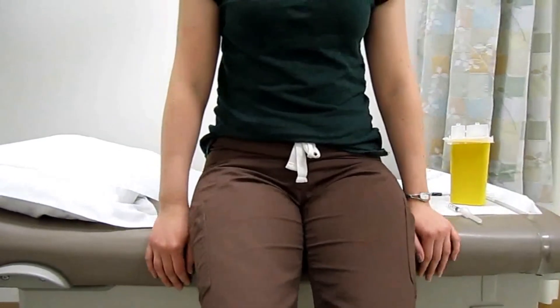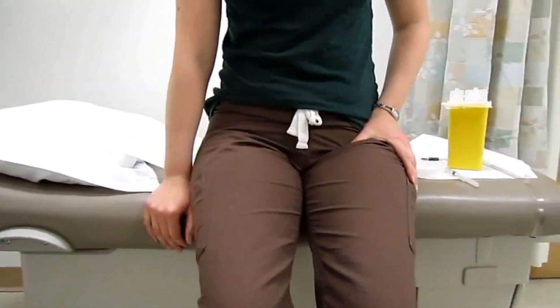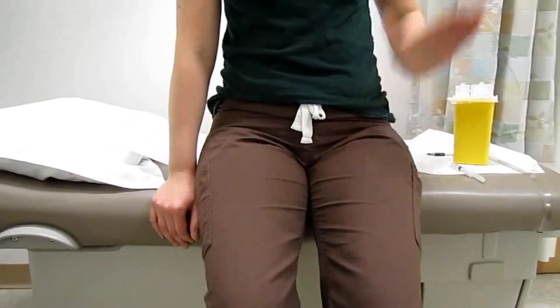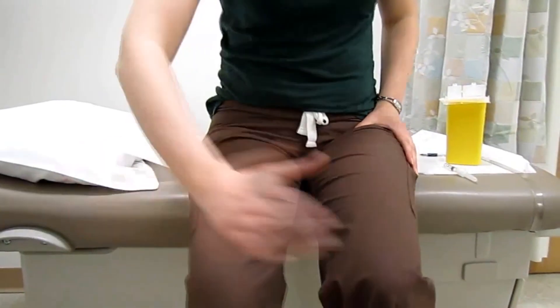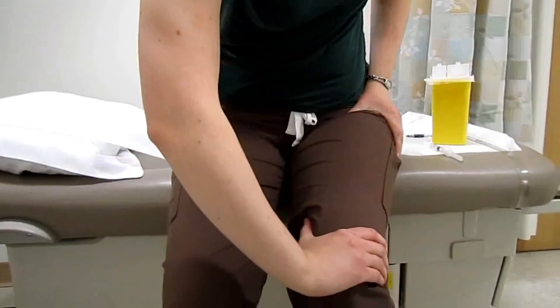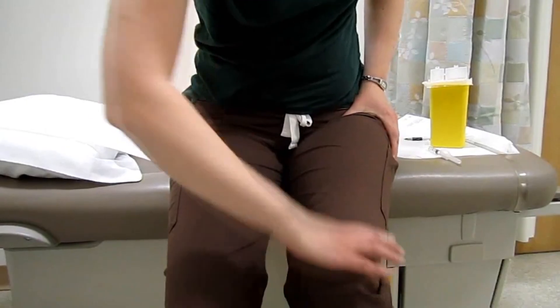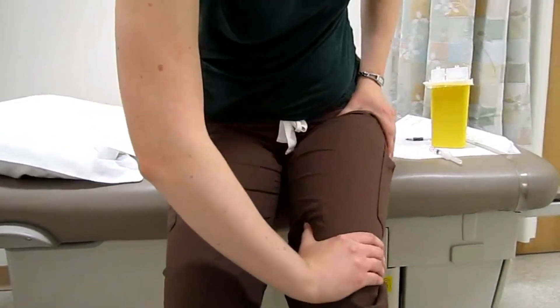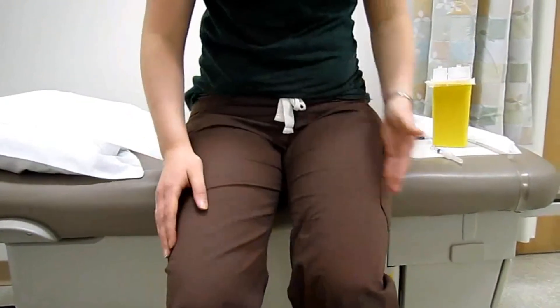If you place the heel of your palm on your hip and the other heel of your hand to your knee, you can inject anywhere in between the space of your hands, from the middle to the outer aspect of your thigh.